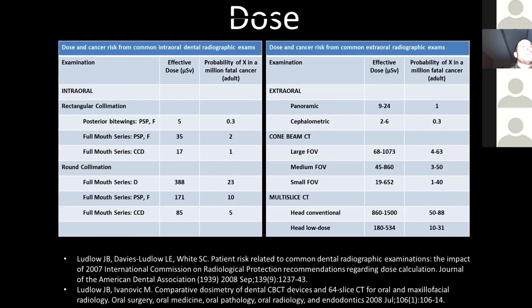Okay. The patient comes in with a radiating pain coming from a quadrant and not a specific tooth, to rule out possible cracked tooth syndrome. What field of view would you recommend using a cone beam CT? As small as possible and high resolution as possible.